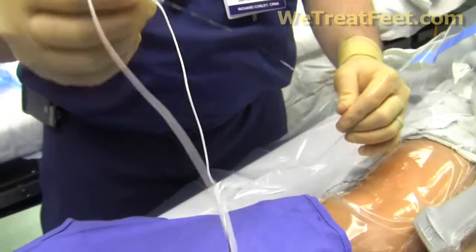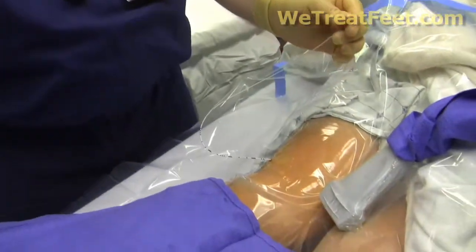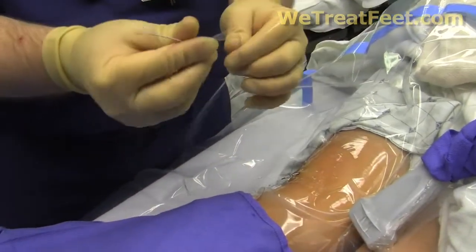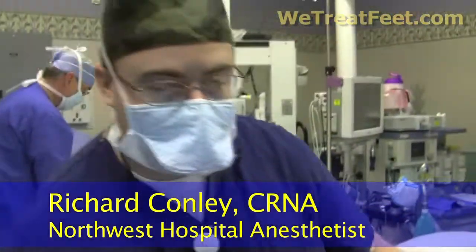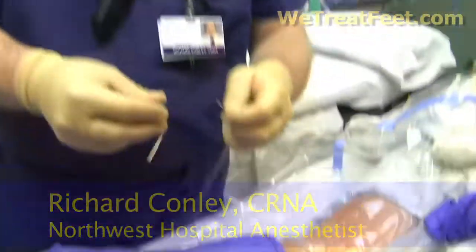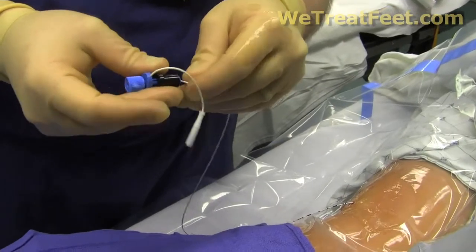So all that remains inside the patient is this very flimsy, very pliable white catheter. So the needles are all out, the metal's all out. The only thing that remains is a soft white catheter. So it's no pain once the catheter is in place.